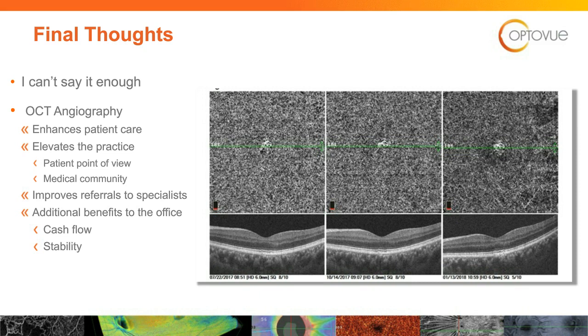I'm not sure if I can click back and find exactly where I want to be in one of these slides. But that's kind of, I guess, 201 and 301 interpretation of these images. That's where the blood flow measurement comes into play. That's where angiolytics becomes so important. And when there's no flow in those drusenoid type of patients, and when there's activity, that's where you'd want to kind of focus on.